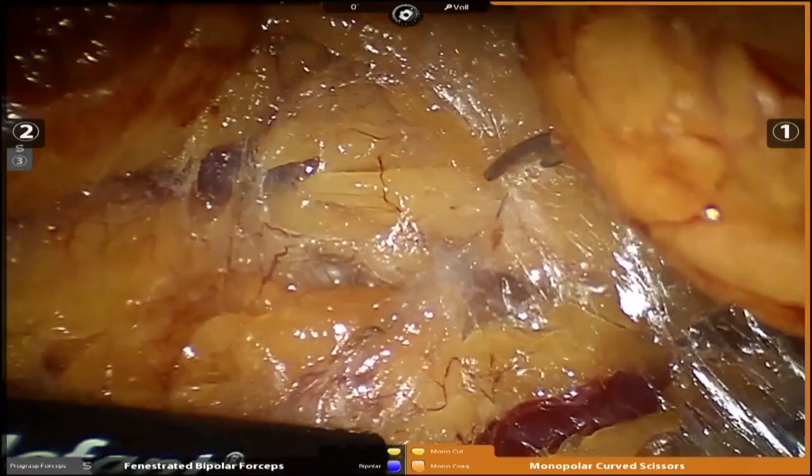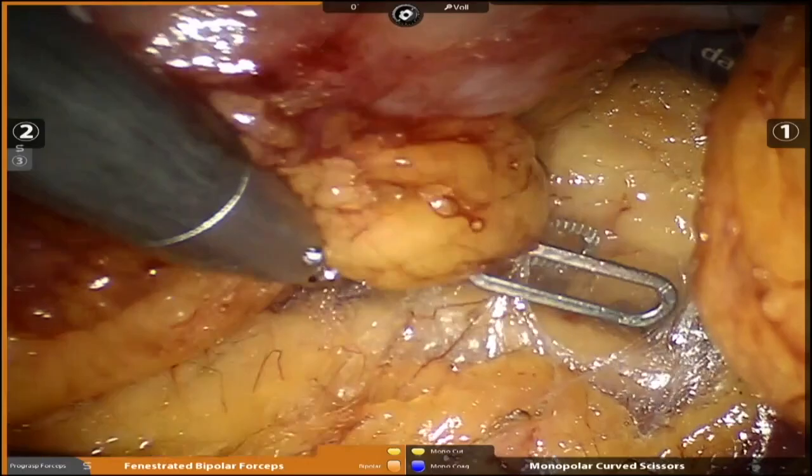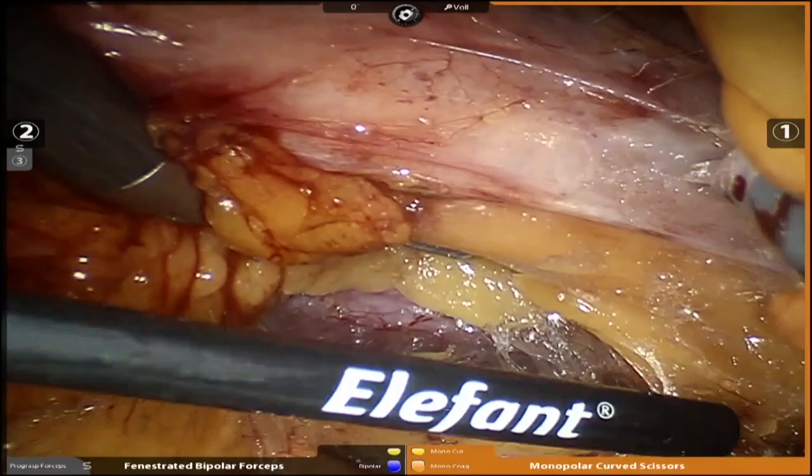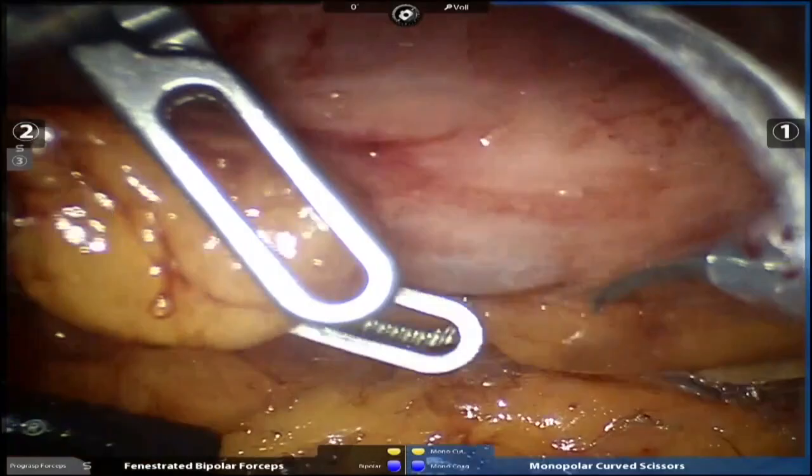And what I'm doing is I'm just going to keep walking on the psoas muscle towards the hilum. There's kidney. And you can see we're almost immediately on the kidney. It's very fast. I'm going to continue to open this up a little bit. Now my fourth arm is up here. I'm going to use that to hold the kidney back a little bit.